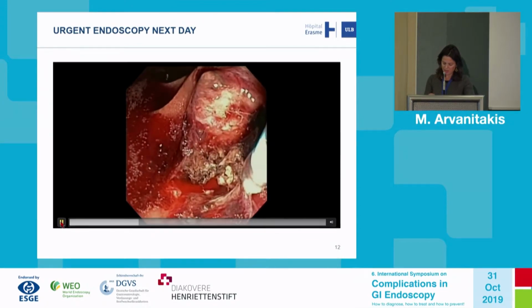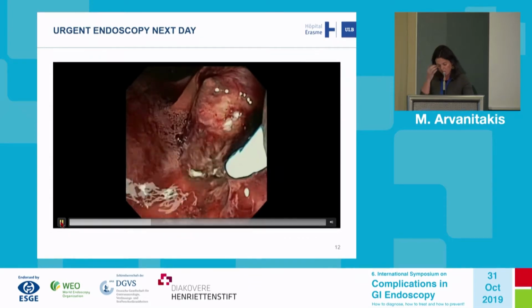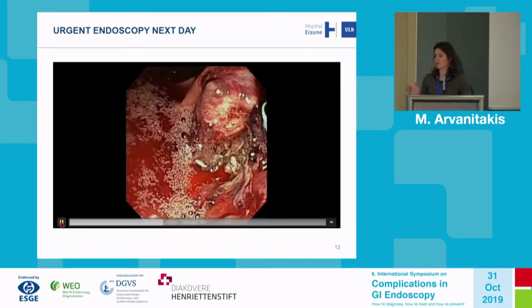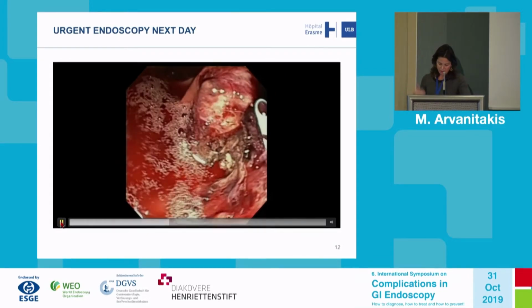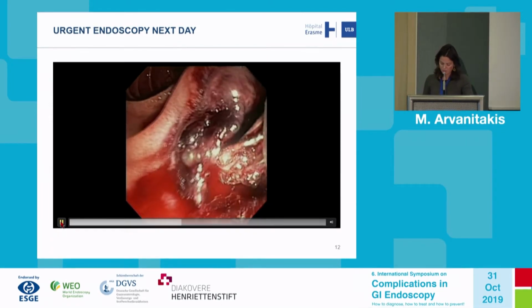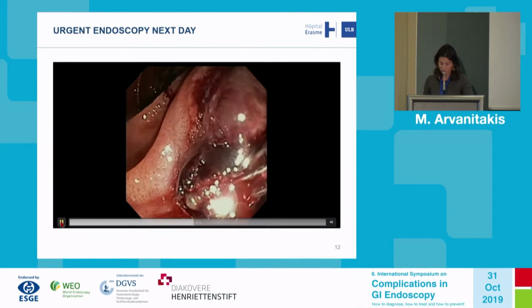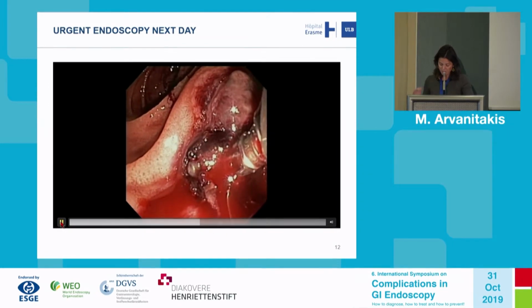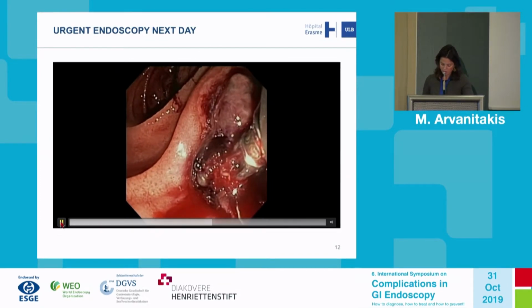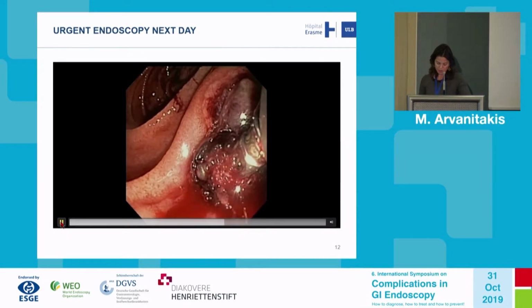And as you see, the stent is still there, which is important, because the second point that is important when you're going to take care of this issue is that you have to identify the pancreatic duct to avoid either using coagulation or putting a clip there. So if the stent is not there anymore, you have to try to find the pancreatic duct and put a stent again. So here we're using a coag grasper. We found the point of the bleeding, and we're going to coagulate very selectively this point.